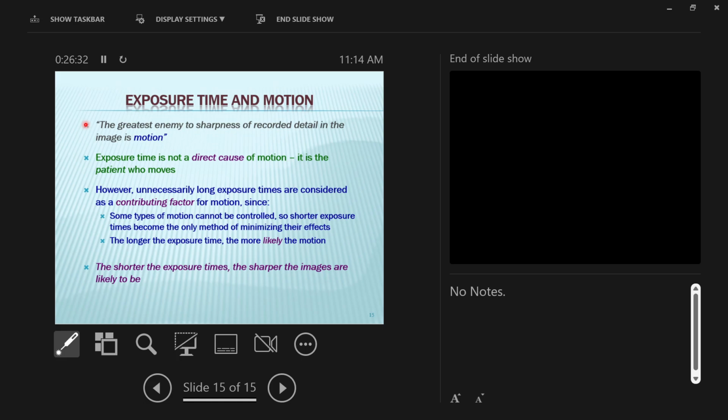And here's how. Time and motion. Okay? As you add more exposure time, you can raise your mAs, right? You can add more X-rays by just letting it go for longer, okay? But motion is the biggest enemy of detail, and with more time, there's more possibility for motion. Think of a chest X-ray, right? The hand or something like that, sure, keep the hand still. Patient has a tremor, we weight the hand down, sandbag on the hand, right?